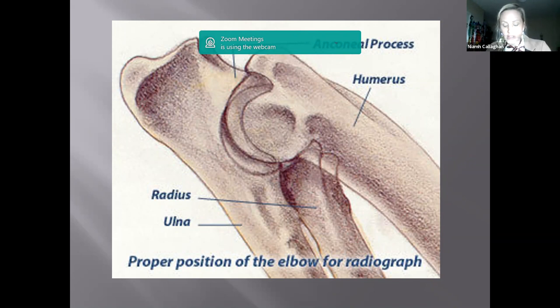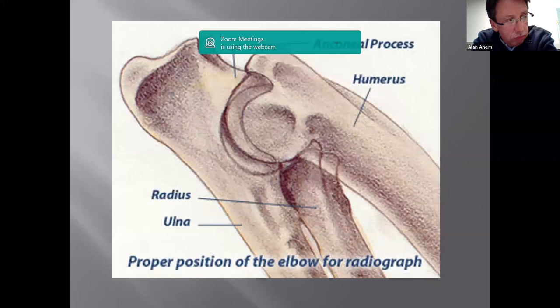Would you recommend a puppy being pre-screened? I guess, would I recommend a puppy being pre-screened? Well, with the HIP extended view, I'm not certain I would, to be honest. I think if the owner had any doubt or any niggling suspicion, then absolutely. But if they were ultimately going to get it done when the dog was 1 year old, I don't think so. Unless they were going to go down the road of the Penn HIP scheme, which you can do from 16 weeks of age. Other than that, I'm not certain that I would.